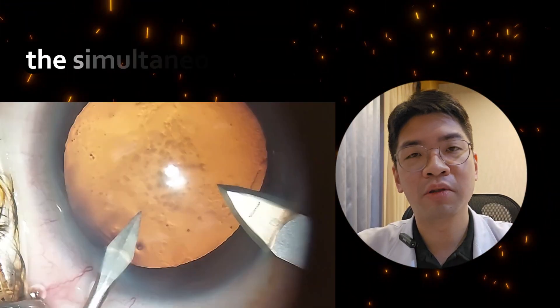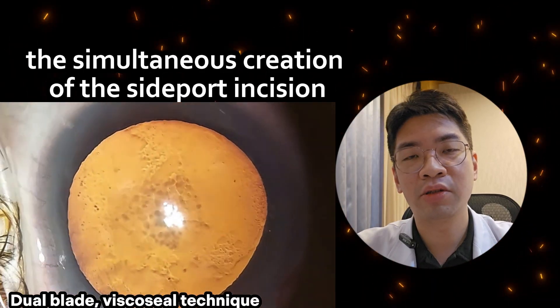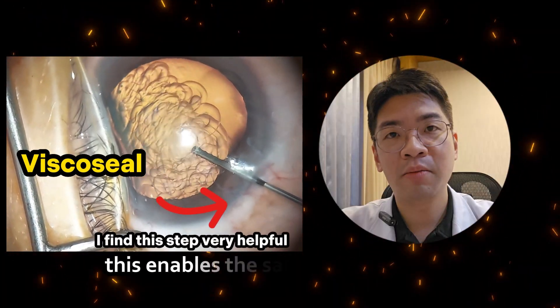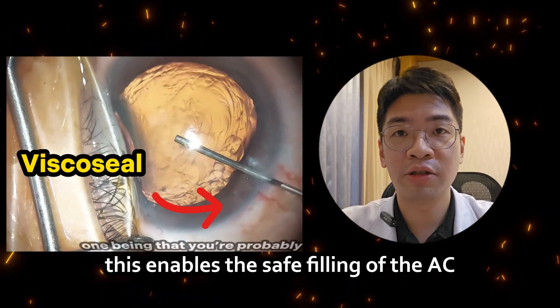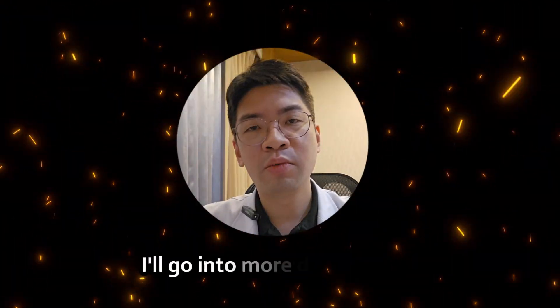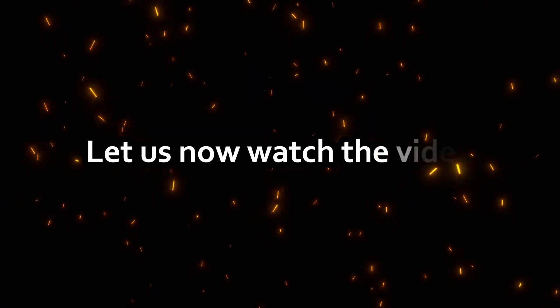This technique describes the simultaneous creation of the side port incision and the main incision, followed by the Viscoseal technique. This enables the safe filling of the anterior chamber with visco connected to a 27 gauge needle. I'll go into more detail on the dual blade Viscoseal technique. Let us now watch the video.